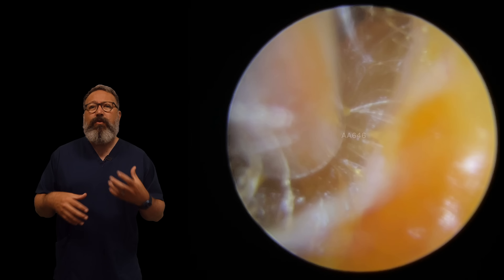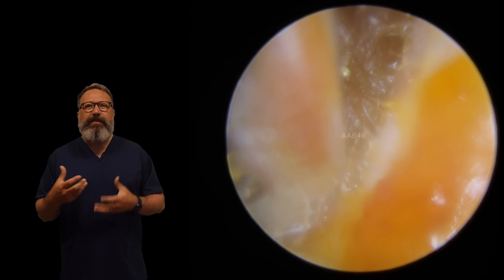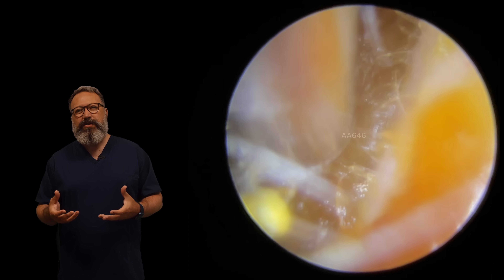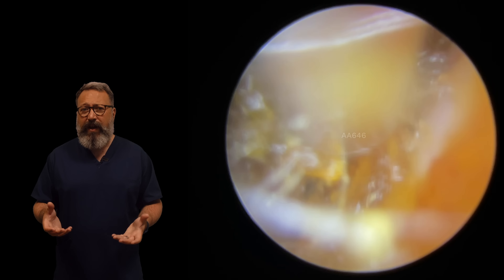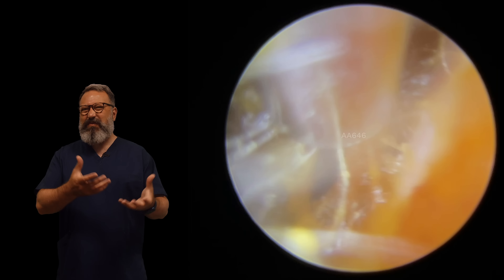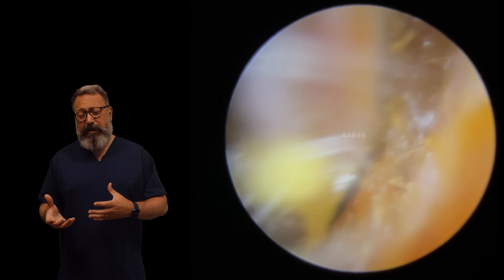We're seeing a few more stickier and sluggier waxes coming through at the moment. I think people are using a little bit more over-the-counter remedies to try and clear wax out. Sometimes those can be really effective, other times it just turns the wax to a little bit of a mush. A lot of the time it depends on where that wax plug is in the ear canal.